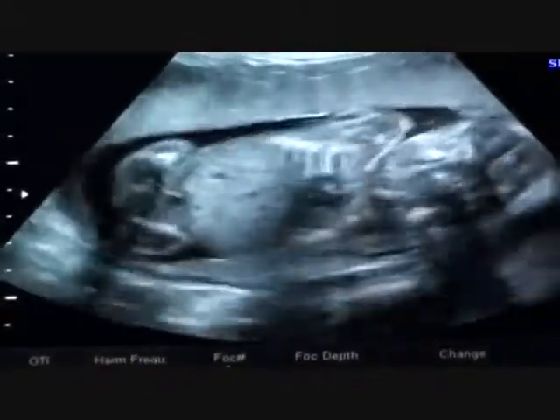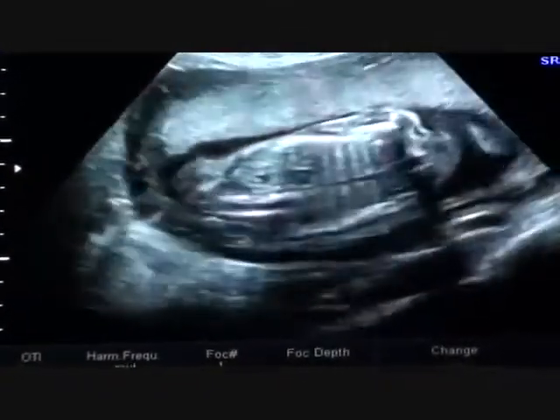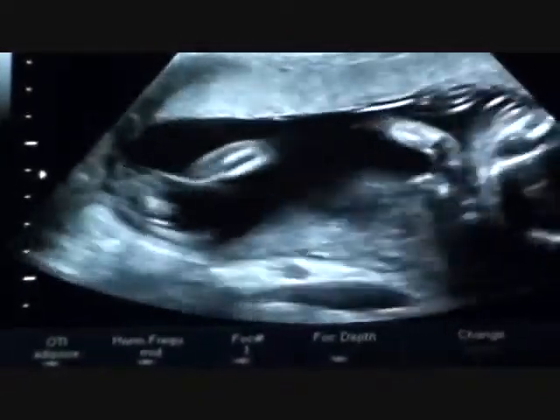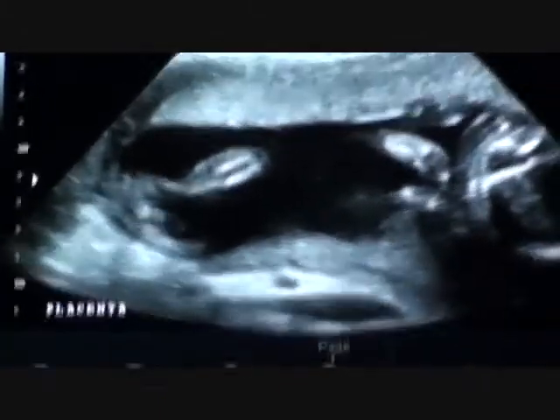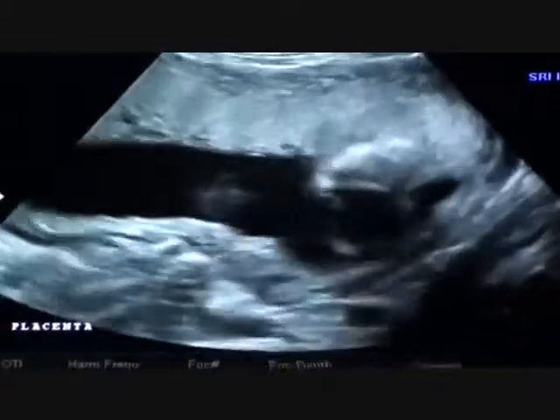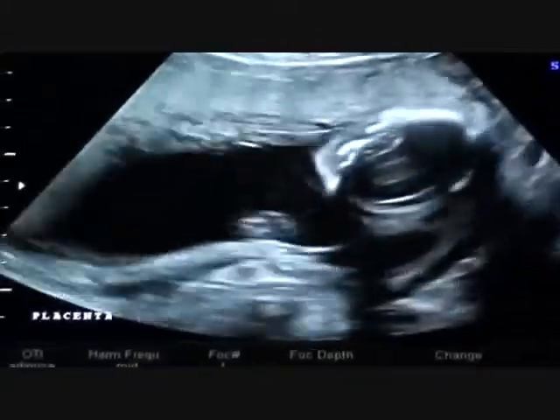I can get a better diaphragm — can flip over like that. Not good for spine, but good for diaphragm. Well, things look great. I'm going to get pictures of your placenta and then be done — get everything charted. Do you mind if I let Flora practice getting the exact same picture? Just a little bit more time to look at baby. Your placenta looks fine, all on that front wall. It's not too low for vaginal delivery, so that's good.